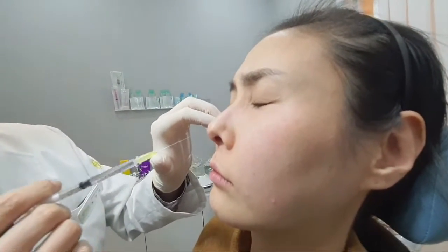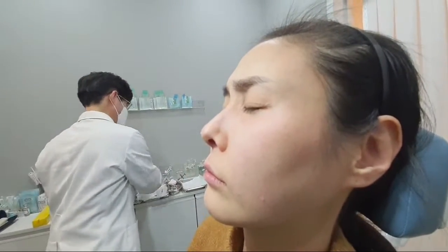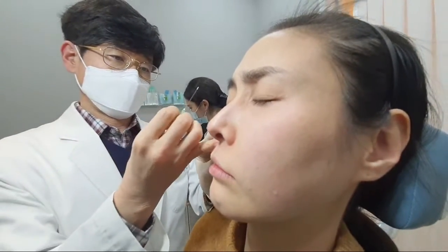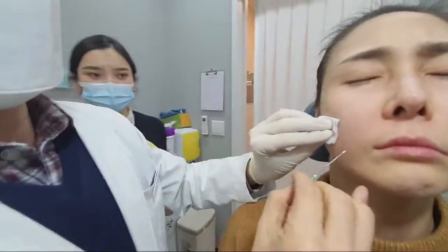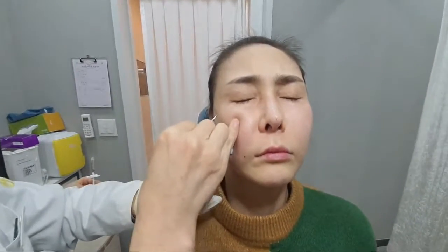So the patient looks like she has a slightly crooked nose. I'm gonna do anesthesia inside her nose. I'm gonna put in the filler to kind of alleviate that crooked nose. He's using the needle to punch the area that is at the point of injection.